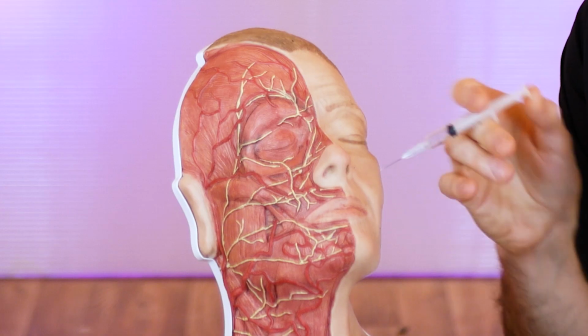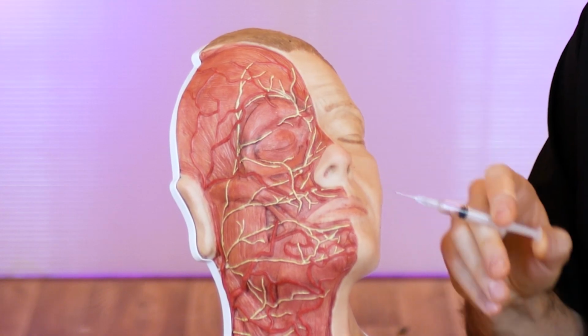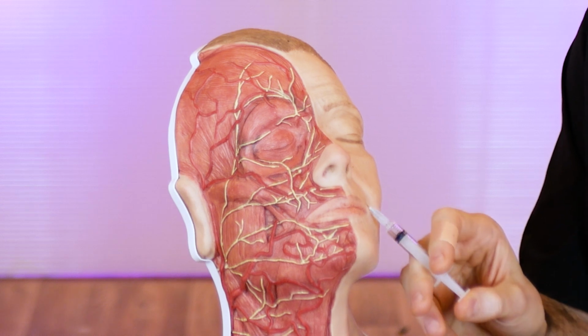I know where I want the filler to be. And actually that's relatively easy. If I use the nasolabial fold example, you can put filler in the nasolabial fold in all sorts of ways that would be reasonable in terms of just purely getting product there. But in terms of safety, it massively restricts you. This is why you don't try and put filler in across like that, because the facial artery runs across that point. So that is still the dominant force. The aesthetics tell me where I need the filler to be, and that's in 3 dimensions.